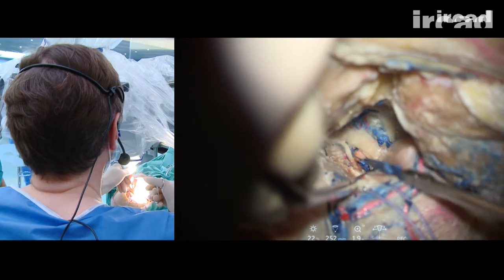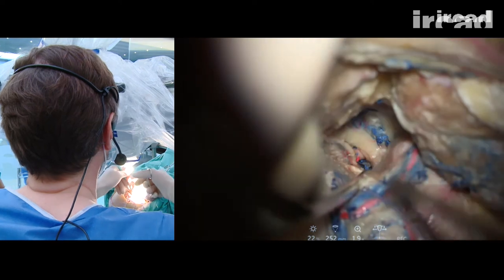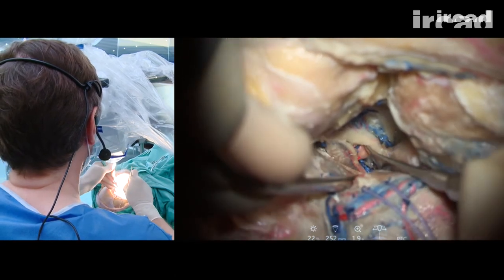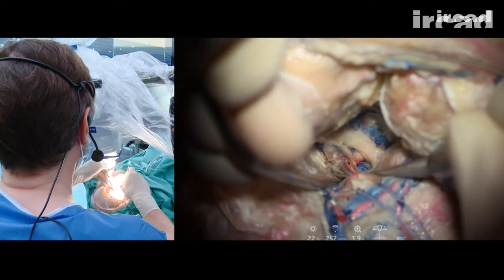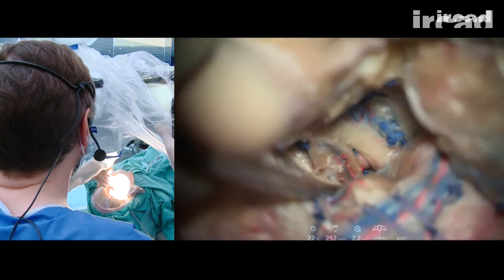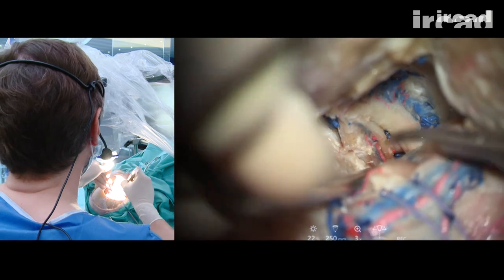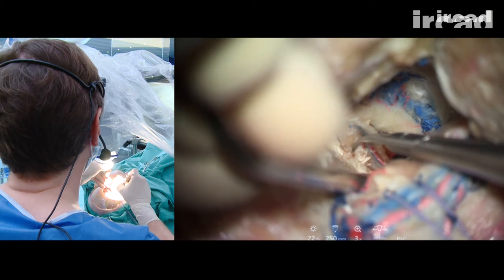We can take a little bit out the venous plexuses. And here, so we clearly identify carotid artery, fourth nerve here. The third nerve is right there. We can open slightly the oculomotor cistern to see third better.